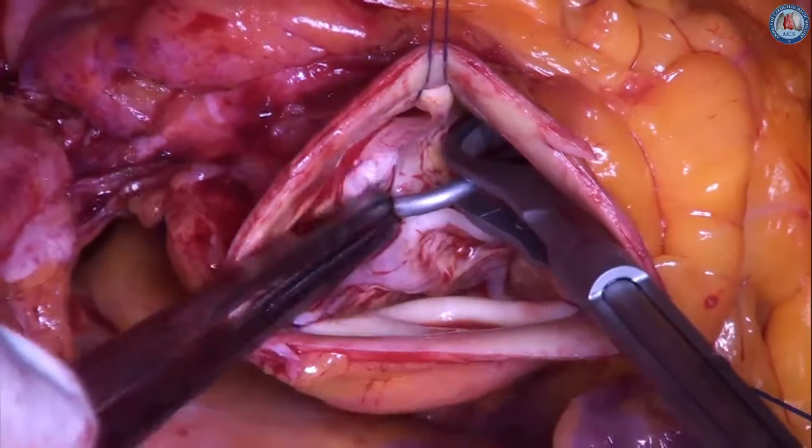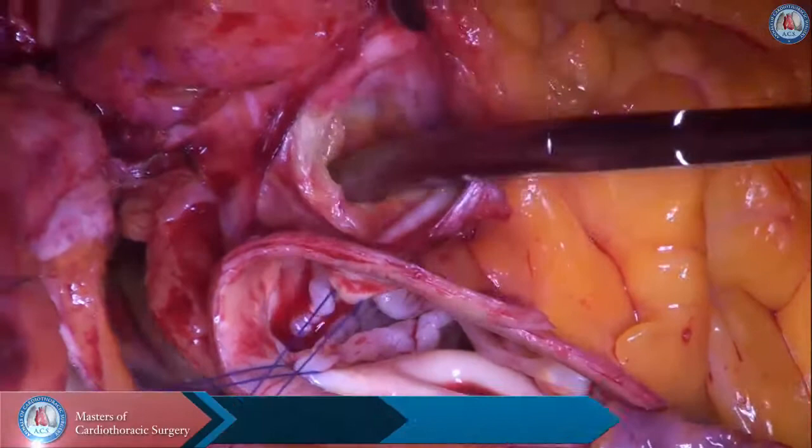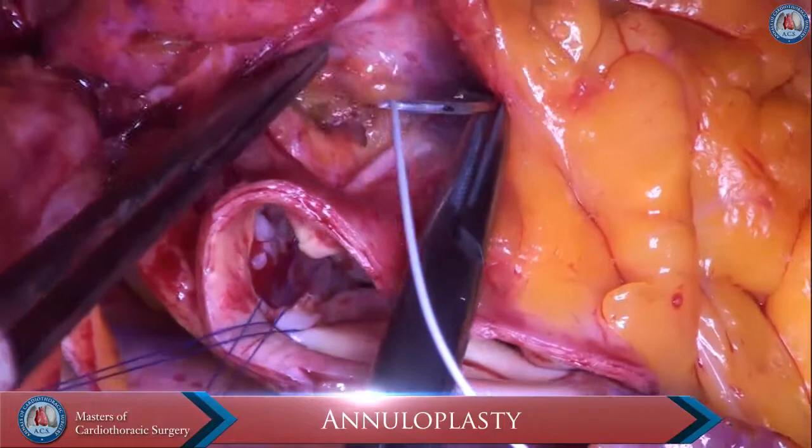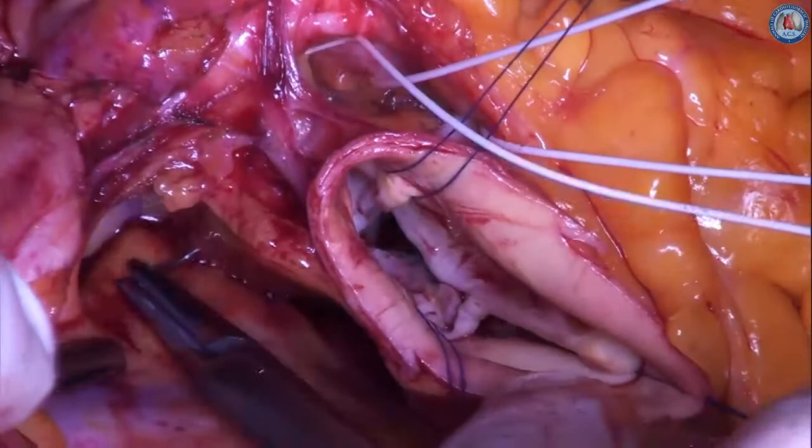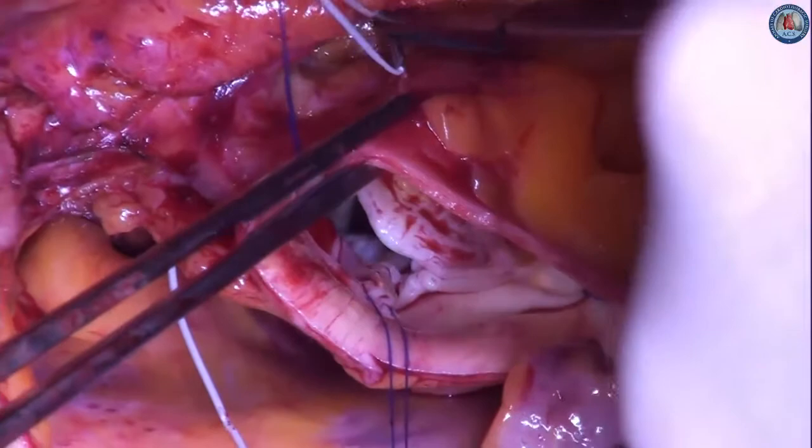A tunnel is created between the left main coronary artery and aortic sinus wall. A strong expanded PTFE suture is placed through septal myocardium outside the right-left commissure. Subsequently, the posterior arm of the suture is passed through the tunnel created previously underneath the left main coronary artery.